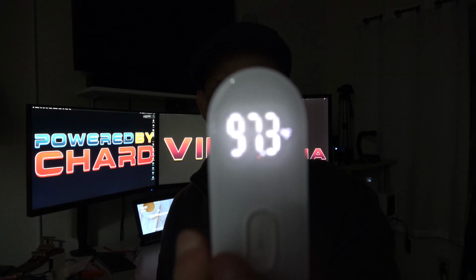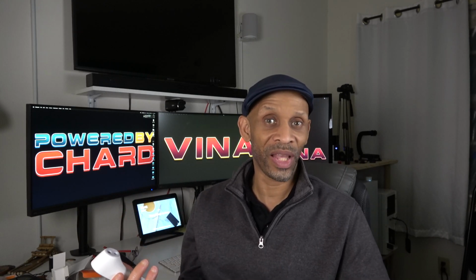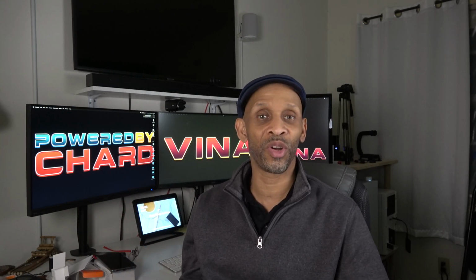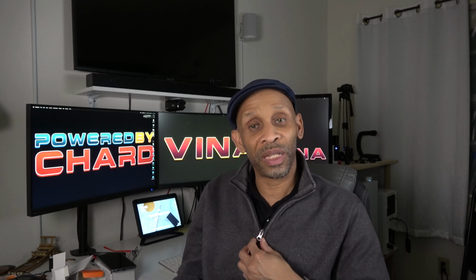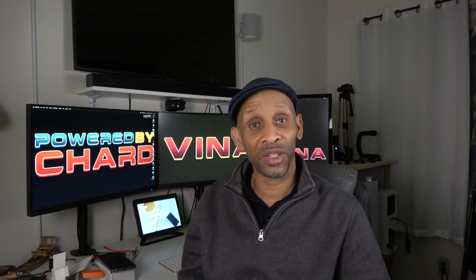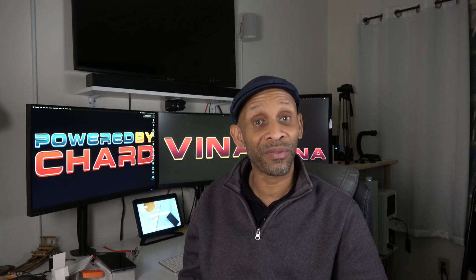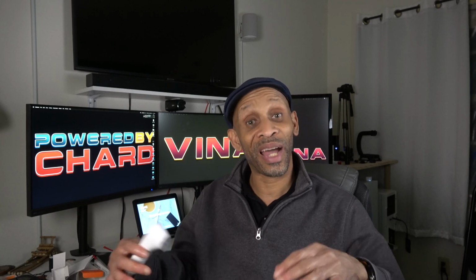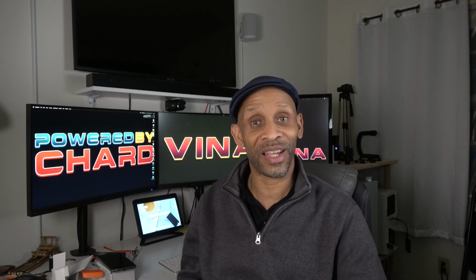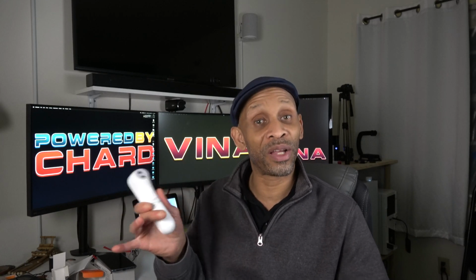There it is, 97.3. My temperature is not elevated because 98.6 is the normal temperature. So I'm running pretty cool. But I feel like I'm warm, you know, maybe because I have this fleece on. So I would think that I have a fever just because my body temperature is elevated, but my actual temperature is not. I'm just feeling that way. So it does work.